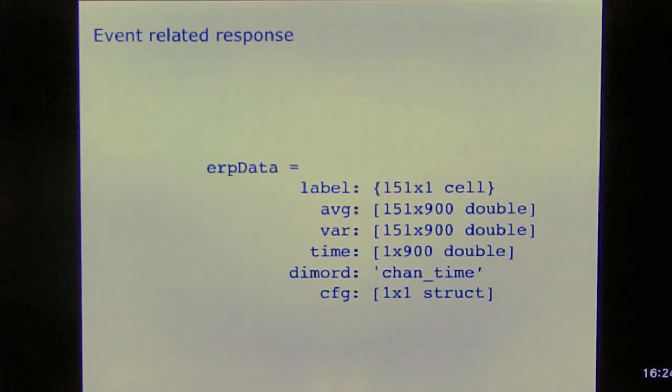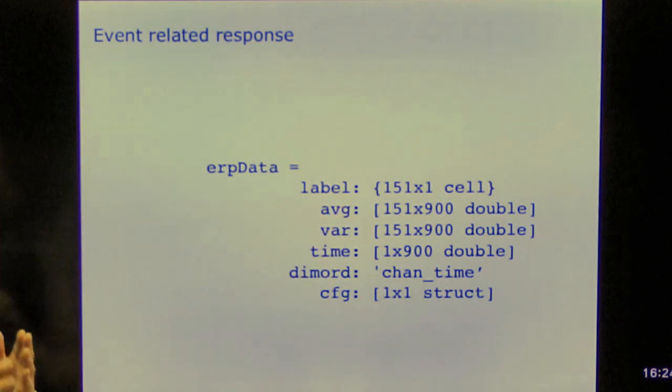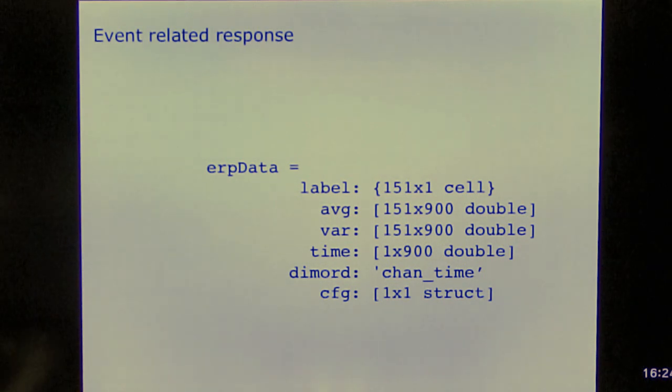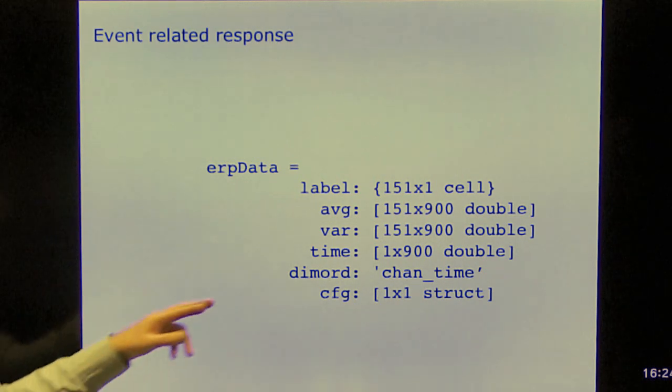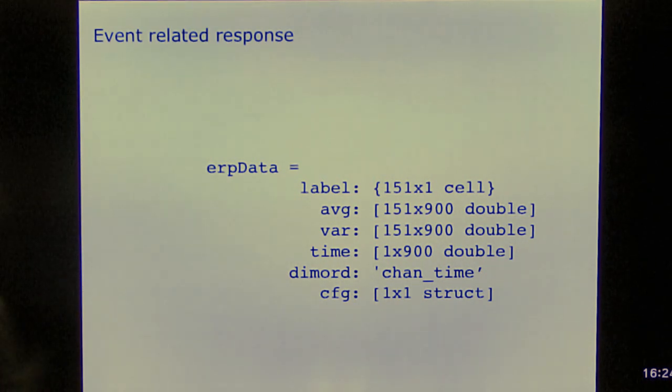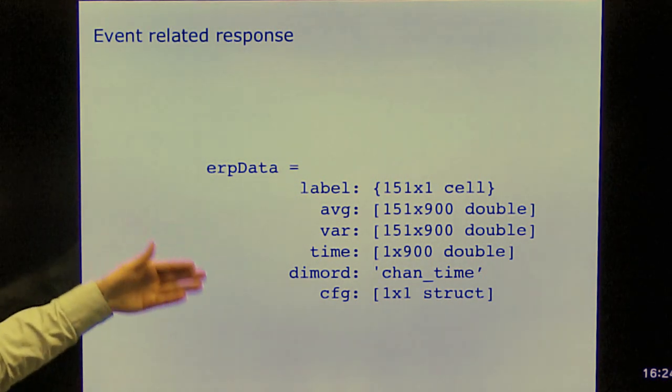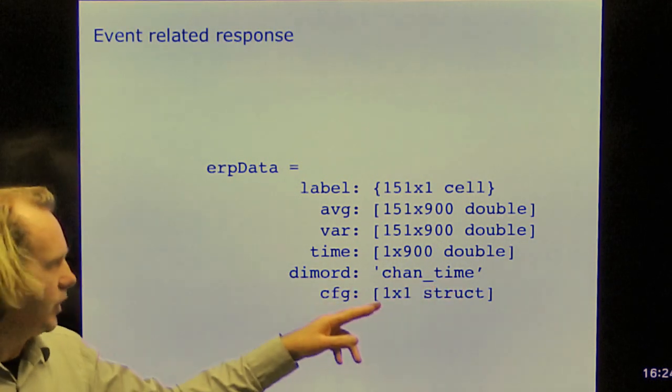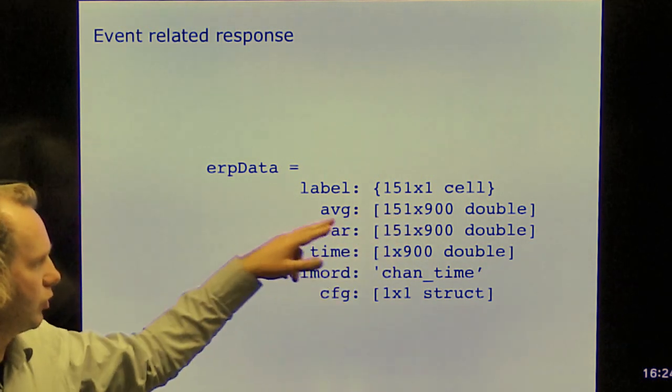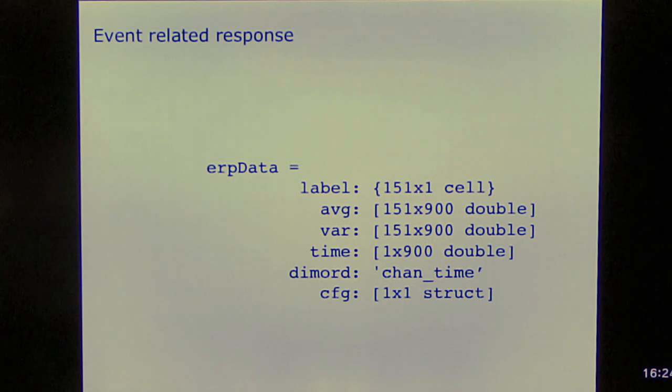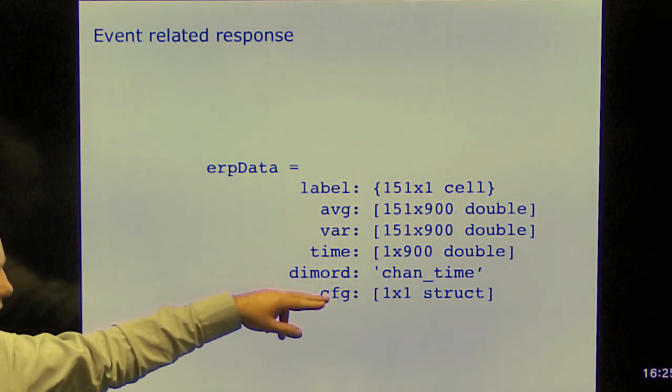This is an example of an event-related field. So what you see is that there's an average, which is 151 by 900. So that's a matrix, and you can directly plot it in MATLAB without using any other functionality. What you also see is that there's labels, 151 strings, and there's a time axis, 900. Also important is this dimord. So the more complex FieldTrip data structures all have a dimord, and the dimord specifies how you can interpret the data. So here the data is still relatively straightforward with channels by time. And if I look at the dimord, I know it's channels by time. Channels, what is 151, time is 900. So anything that is 151 by 900, which also includes the variance, can be interpreted as channels by time. If you go to frequency analysis, and if you keep trials, then you can have up to four-dimensional structures. If you go to source space, you can have up to five-dimensional structures. Three dimensions for space, and then time and frequency. So that's why it's important to keep track of all these dimensions. And again, it has this configuration structure.